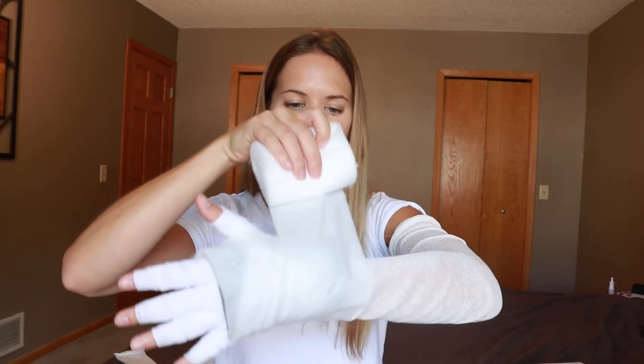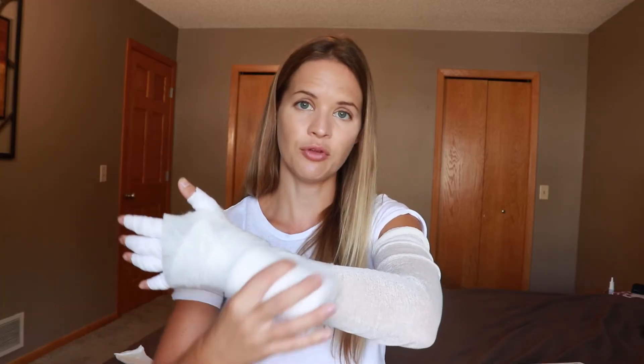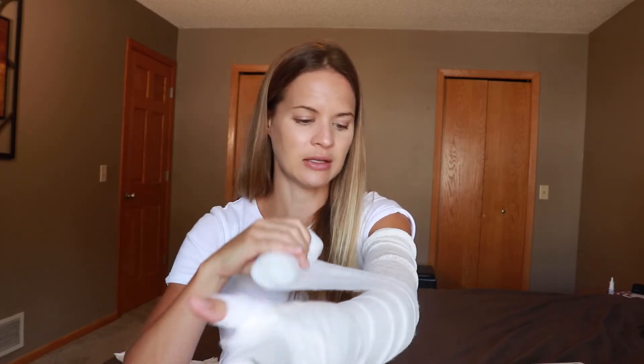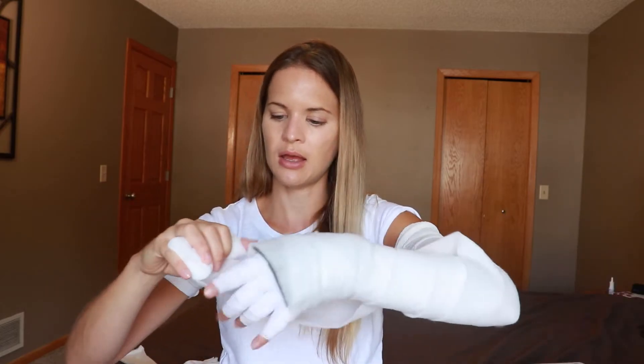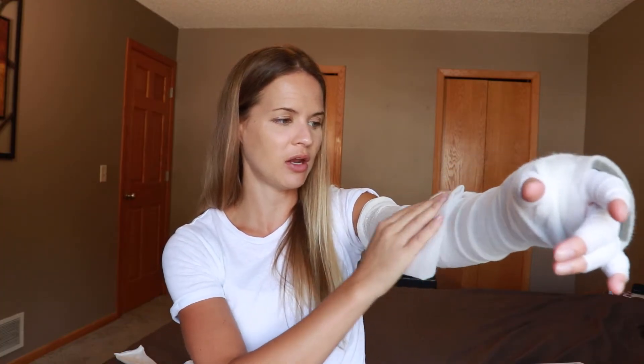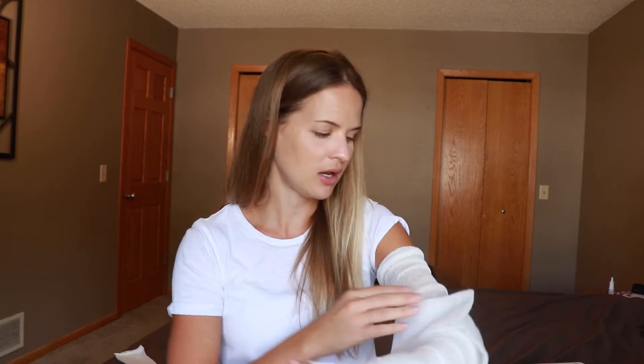From there, just spiral the padding up the arm, overlapping about 50% — same with Rosadol Soft or the thicker foam. If using gray foam, you can try using something like Artiflex over the top of the foam to keep it in place. Getting to the elbow crease, I want to put a little more padding there, because it's another area that gets uncomfortable if it causes a tourniquet where it rubs in. With normal clothes that go to the elbow crease, fabric tends to bunch up and tourniquet, so adding a little more layering there can help avoid that.